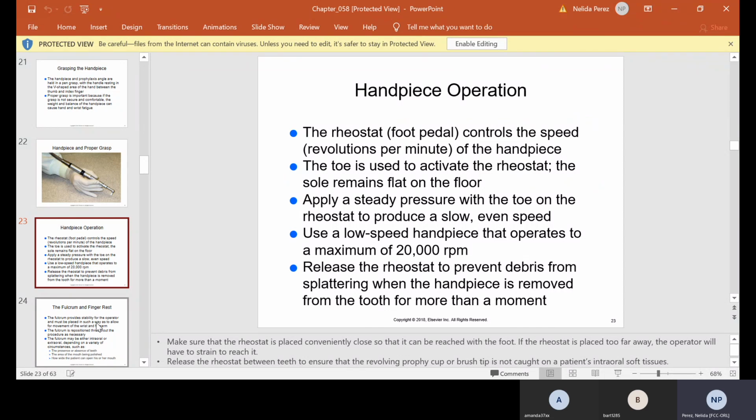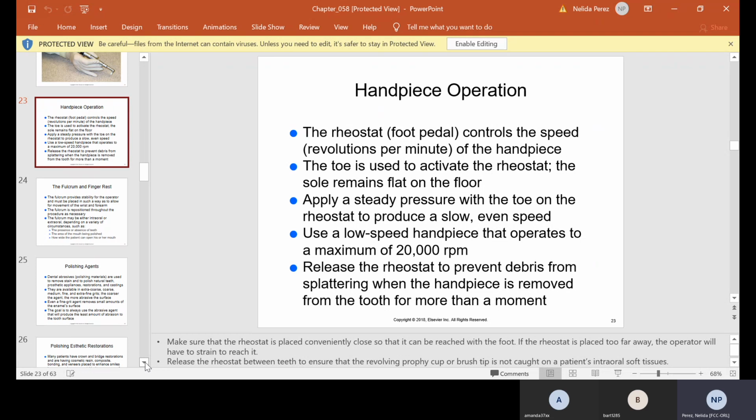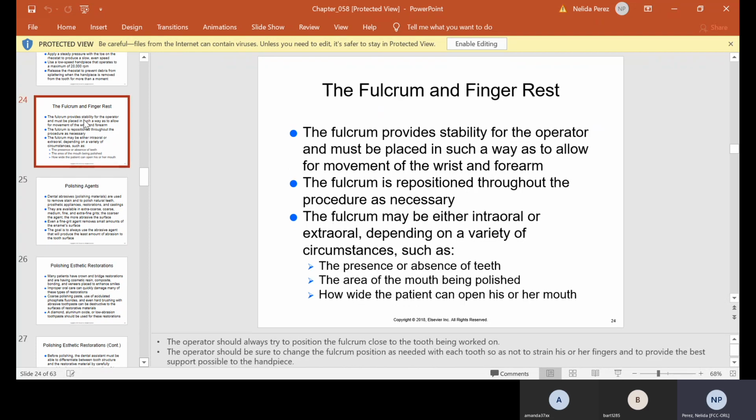Release the rheostat to prevent debris from splattering when the handpiece is removed from the tooth for more than a moment. So the rule of thumb is when you're inside the patient's mouth, you step on the rheostat. When you take the prophy angle outside of the mouth, step off the rheostat because you don't want it to spin outside of the patient's mouth. If you do, it's possible that whatever was in their mouth, whether it was the paste or the saliva, starts rotating all over the place. It may even splatter on you, get in your eyes, get the whole entire office or operatory contaminated.